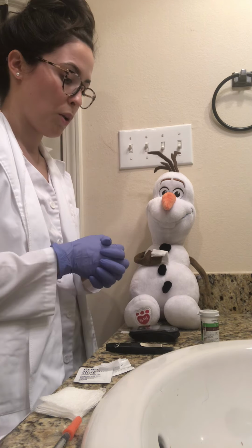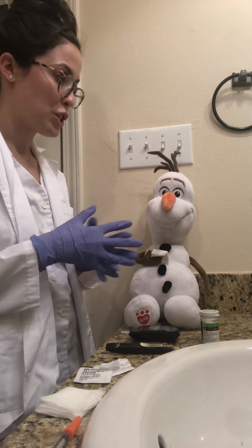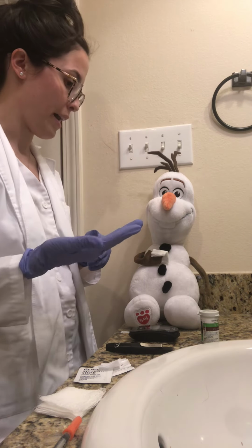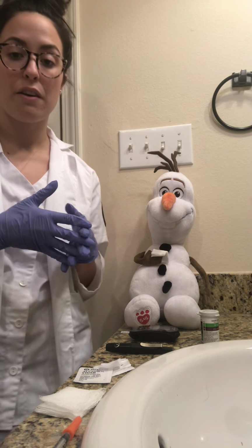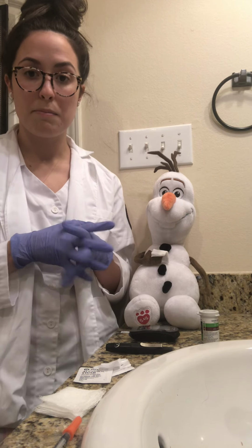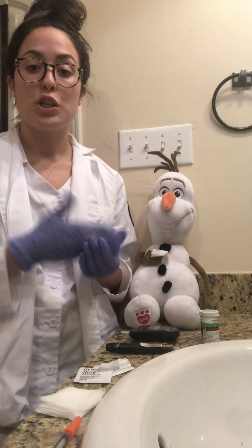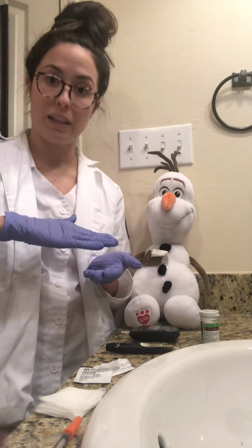And Mr. Olaf, what 180 means is it is a little elevated prior to eating, and we just want to give you some insulin based on the physician's orders before you have lunch, just so your sugar doesn't get too high. While discussing this with Mr. Olaf, you want to perform a little focused assessment and check for different signs and symptoms, as well as a readiness to eat, because like I said, lunch is coming up, and we don't want him to not have any readiness to eat when his blood sugar is 180 and we're about to give him insulin to drop it low.